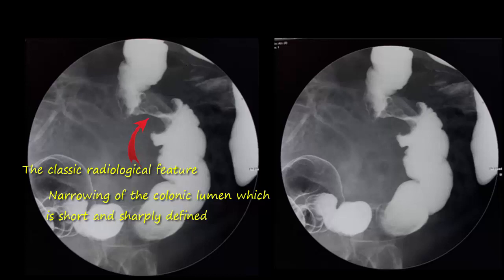It has overhanging margins, usually has ulcerated mucosa, and an eccentric and irregular lumen. The colonic stricture is usually 3 cm to 4 cm in length and rarely exceeds 6 cm.